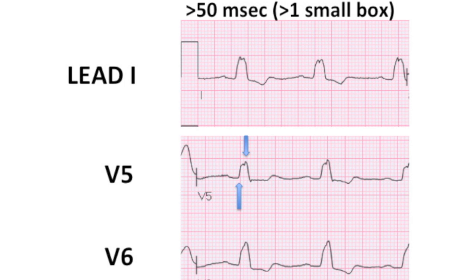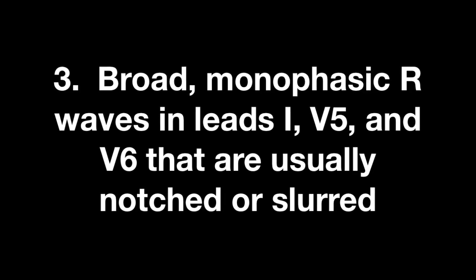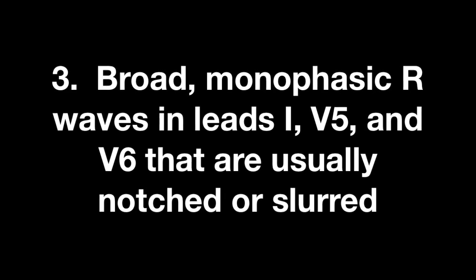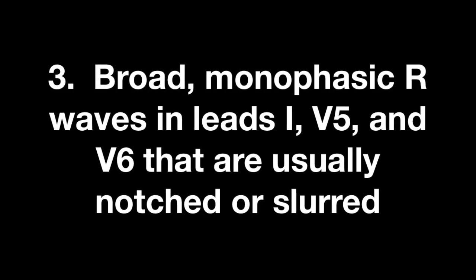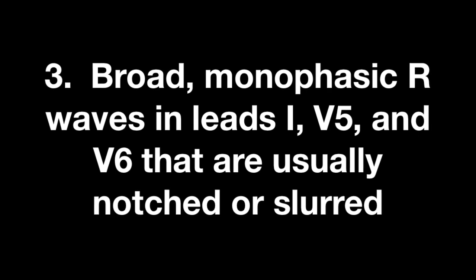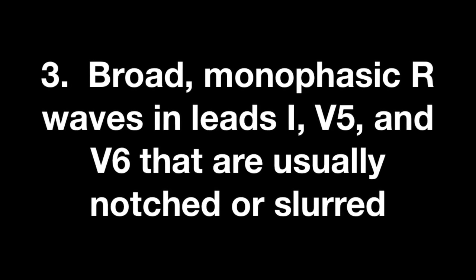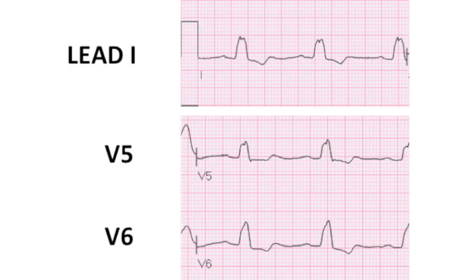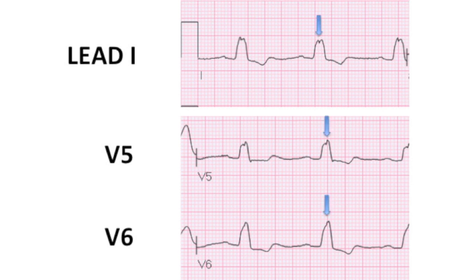The third ECG criteria is a broad monophasic R wave in leads I, V5, and V6 that are usually notched or slurred. Looking at leads I, V5, and V6, you will see that the QRS complexes in lead I and V5 are notched, and the QRS complex in lead V6 is slurred.